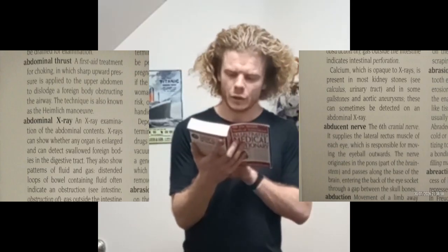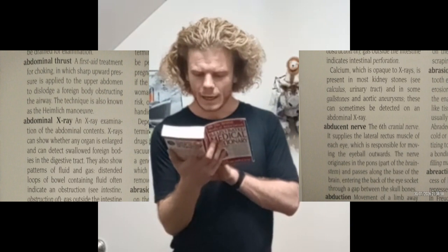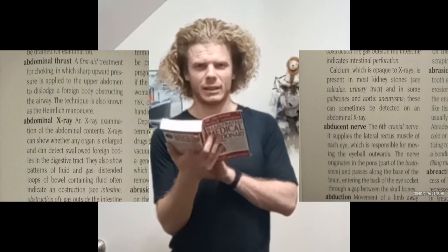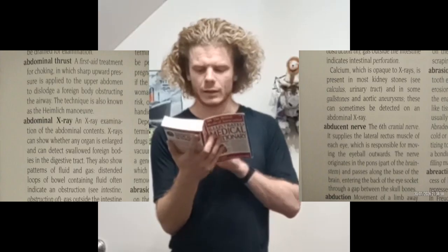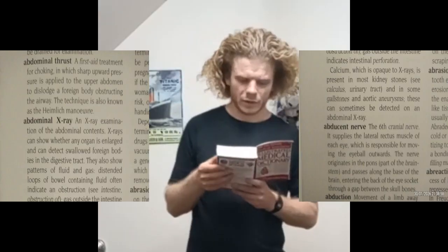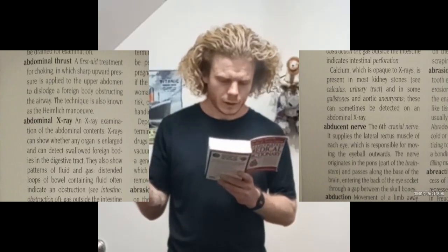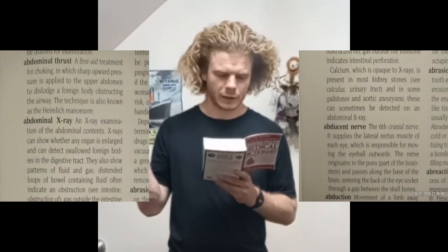Now, calcium, which is opaque to X-rays, is present in most kidney stones and in some gallstones and aortic aneurysms. These can sometimes be detected on an abdominal X-ray, where an X-ray is done of the abdominal contents. It can show enlarged organs or swallowed foreign things in the digestive tract.